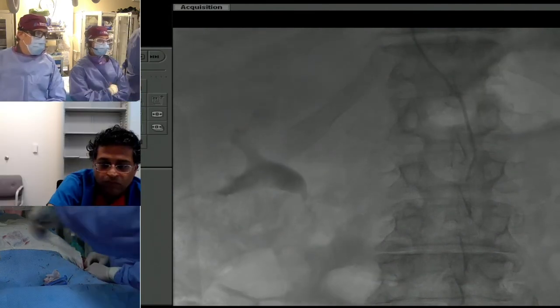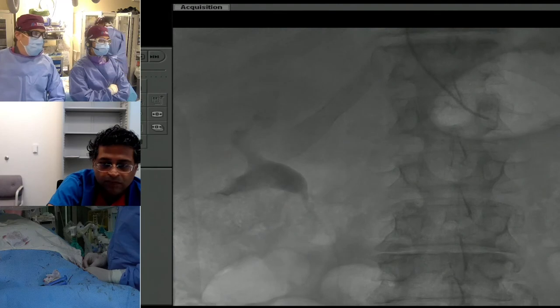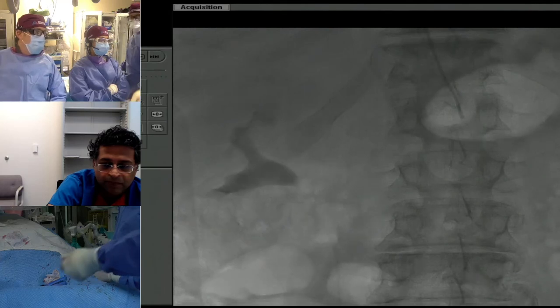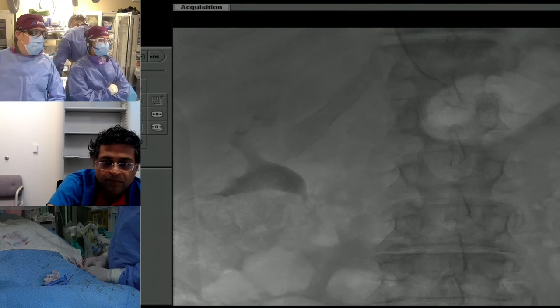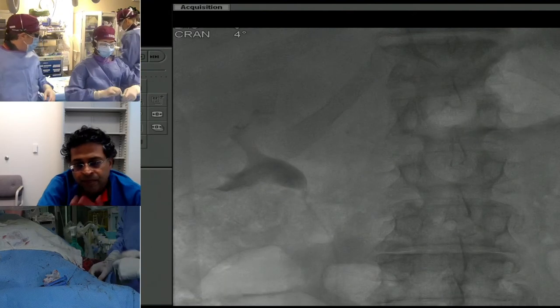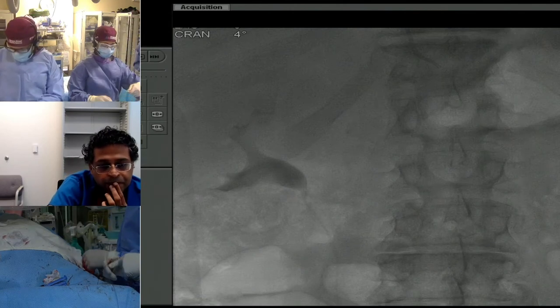It's actually pretty challenging to get it to face that side. I don't think it's the actual shape of the catheter, I think it's just the tortuosity of the arch. So I'm trying to straighten it out with a stiff glide wire here. But it's not really facing that side. We could also do a guide cath, we have a slender sheath, but I don't know that that's really necessary.